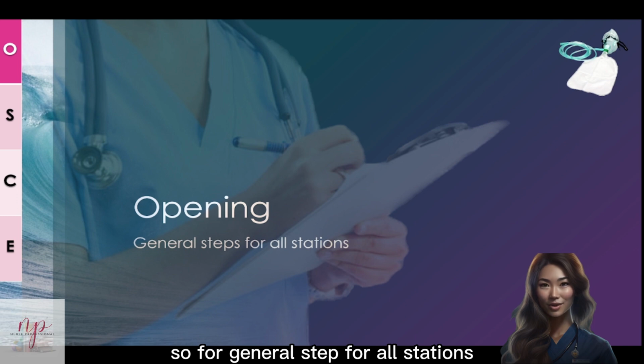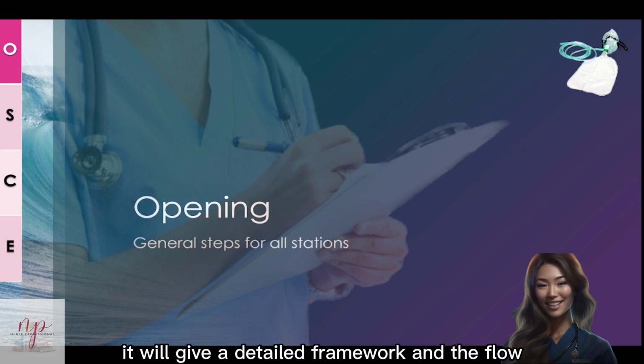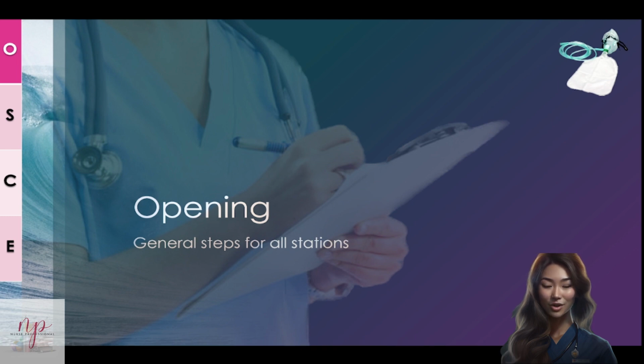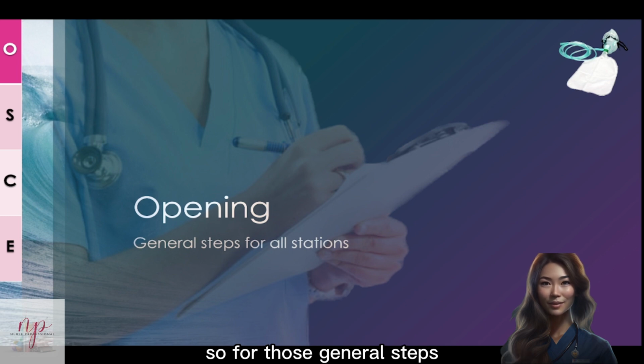So for general steps for all stations, please refer to the video of OSCE Framework. It will give a detailed framework and the flow of how to perform the procedural skill stations. So for those general steps, I'll go over it very quickly.